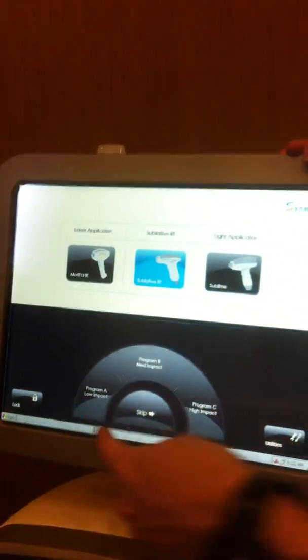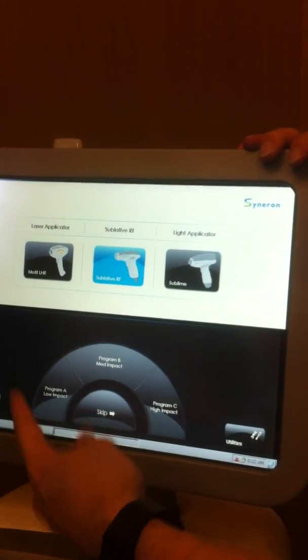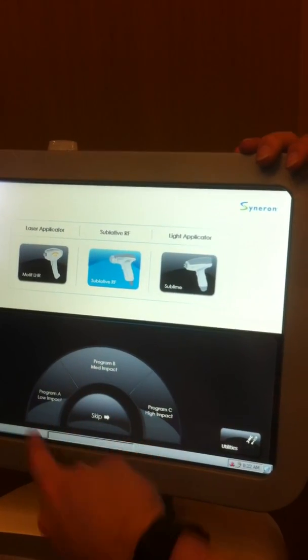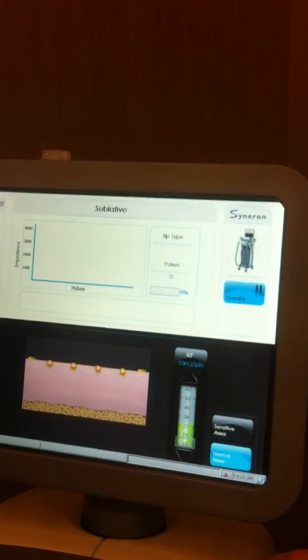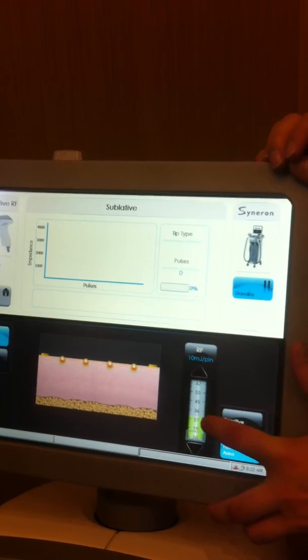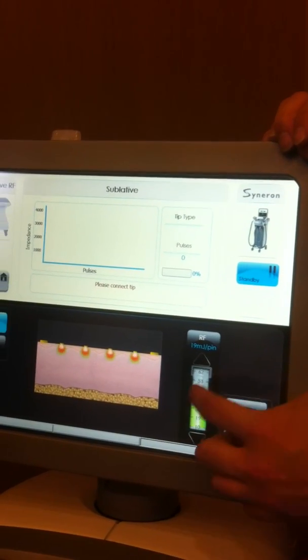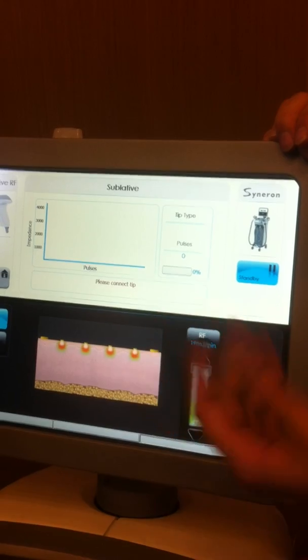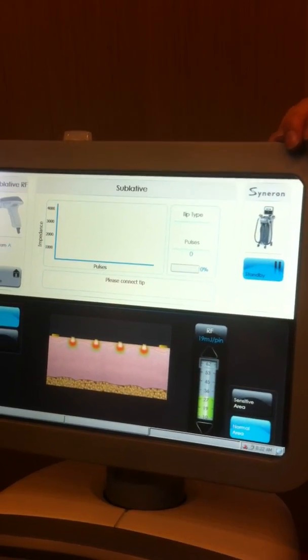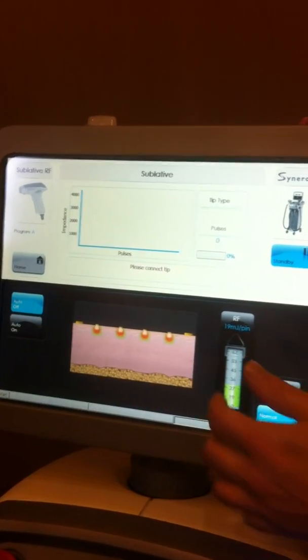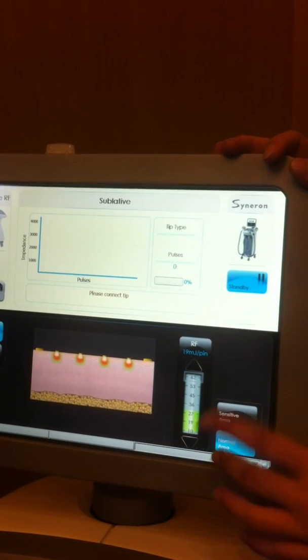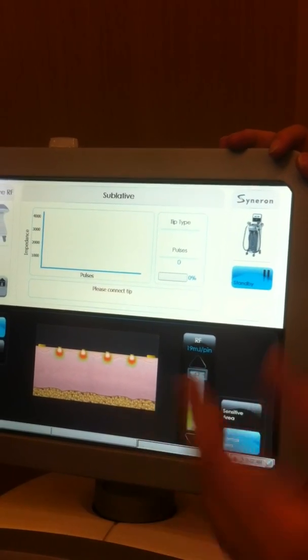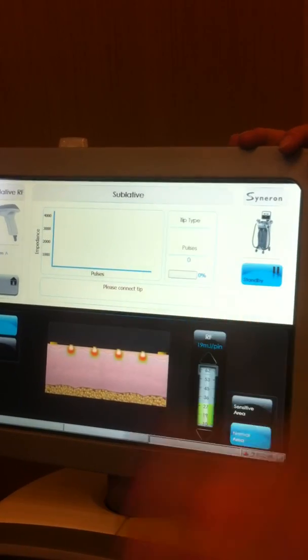So we'll go home. We can select the other one. If we select sublative, you get your familiar speed dial A, B and C. When you click on the program, it highlights here just like the other programs do and you can go to the full energy scale. I go up to 62. I see that my graphic changes, have auto on, auto off, and then normal and sensitive just like I have in the other one.